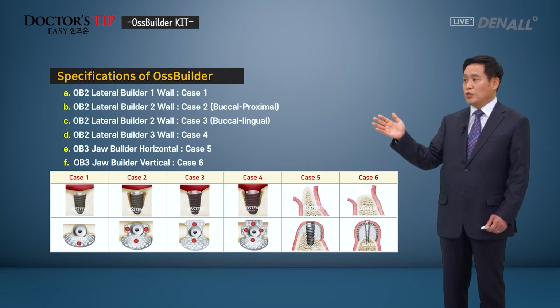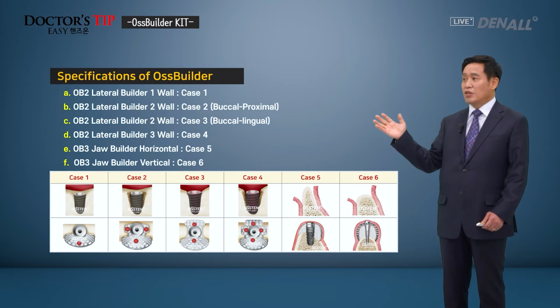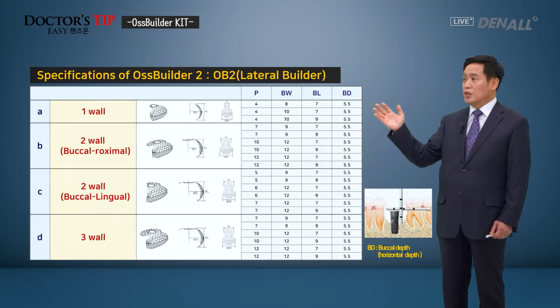When you use the jaw builder, this is the same. On number 5, you can attach to the fixture, or for case 6, you can use the tenting screw without an implant fixture to connect it. There are multiple options. You can measure the defect that you want to treat and choose the OssBuilder that fits. Let's look at the measurements.